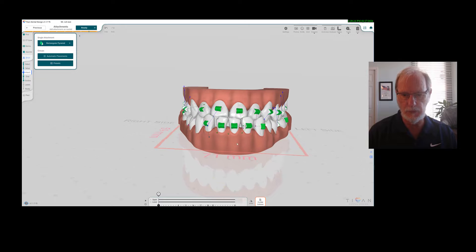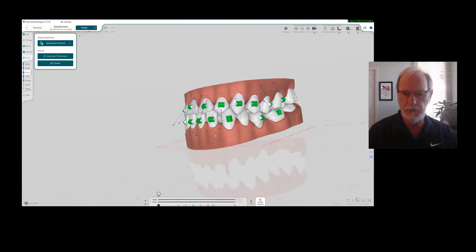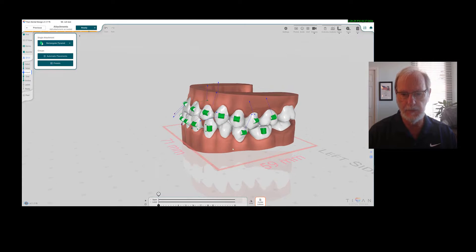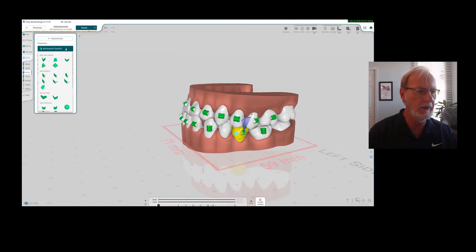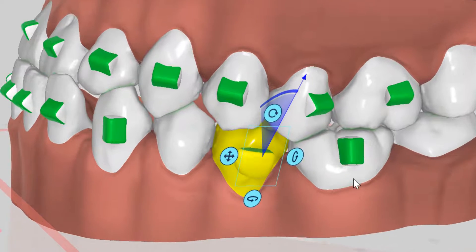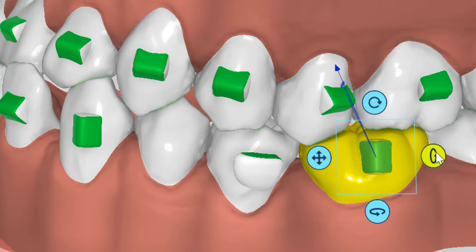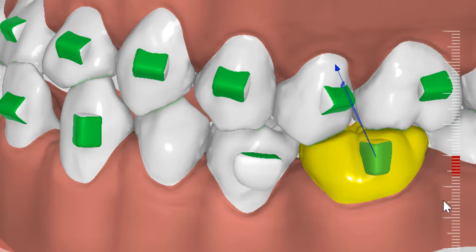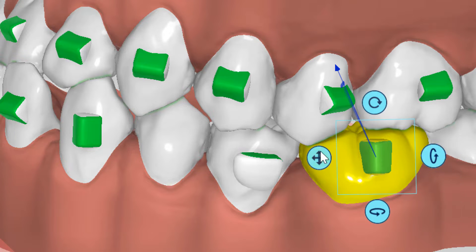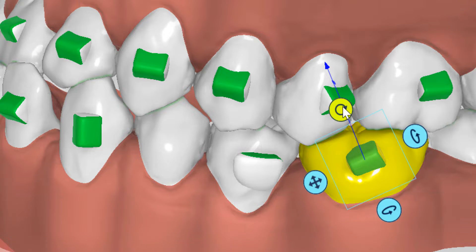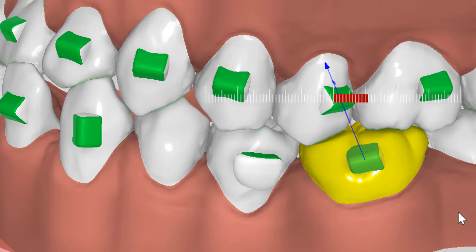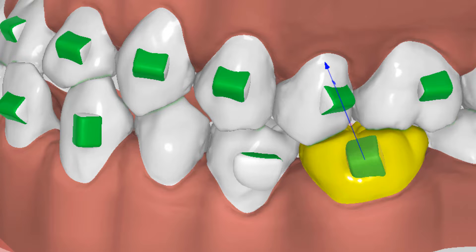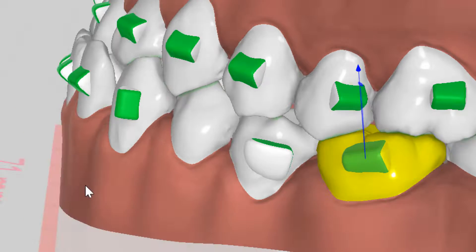The attachments are already put on. This one is kind of a... let's change this one for demonstration purposes. So I will use a rotation attachment like this one. Again, you can change whatever you want. Big advantage too is you can move the attachment, you can see it, you can move it in different directions. You can obviously rotate it. You can do all these things that you are interested in doing, and something I would also like is you can make it wider, you can make it longer, you can change the depth.